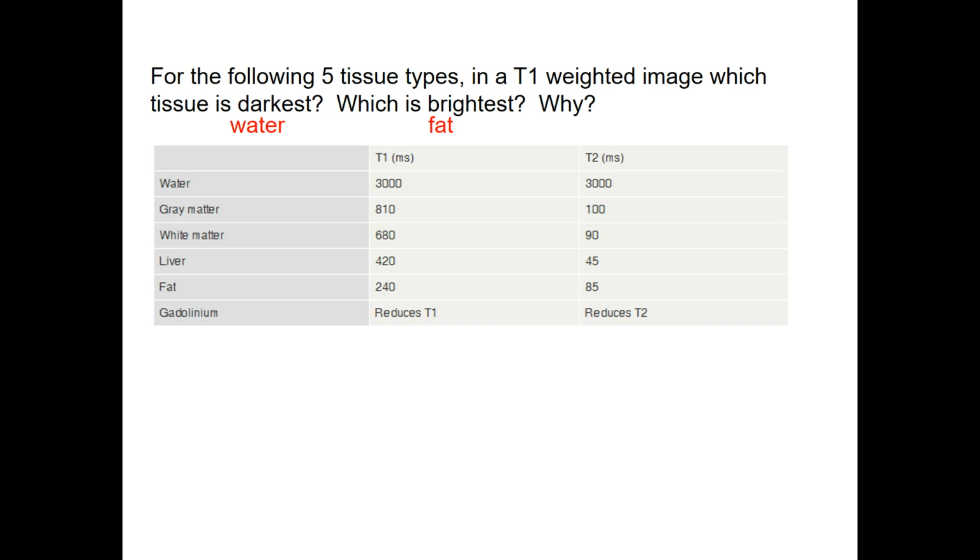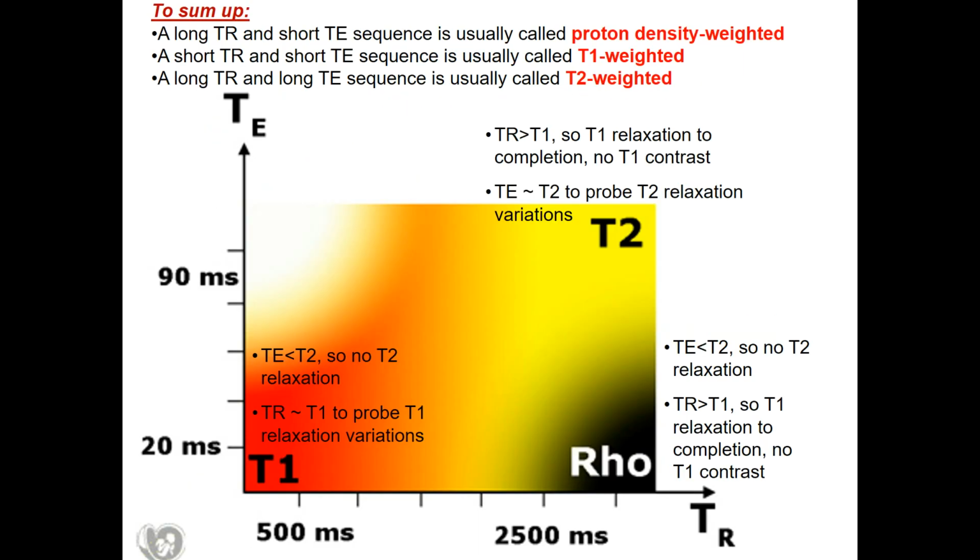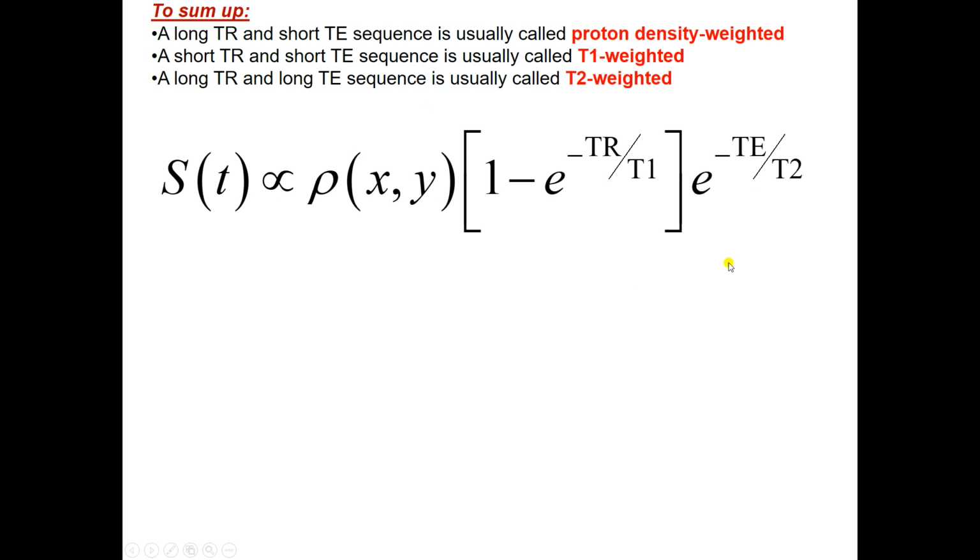All right, well, remember, you choose the repetition time. Go back to your equation. This is the term that controls T1 weighting.